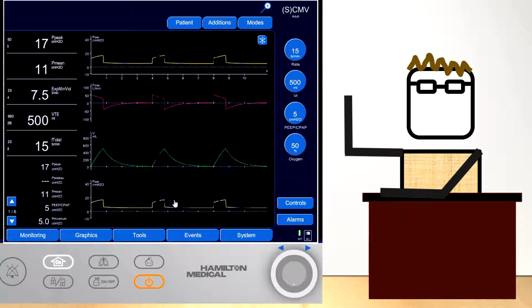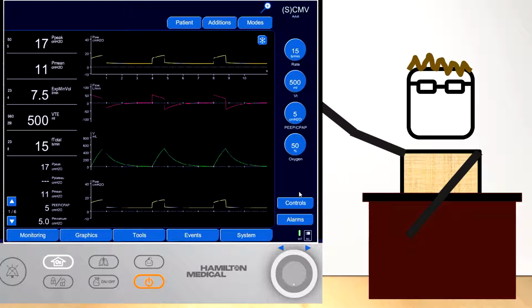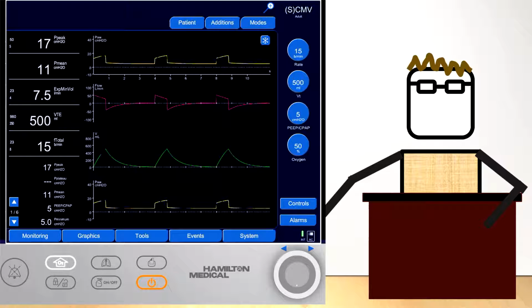The user does not control the pressure that results from the set tidal volume, and this is dependent on the airway resistance and the lung compliance, as we've previously discussed with the equation of motion and the relationship between volume, pressure, and compliance.